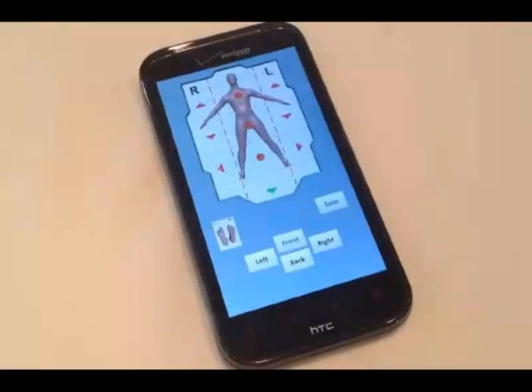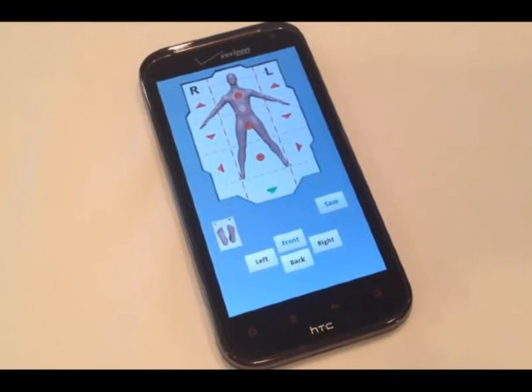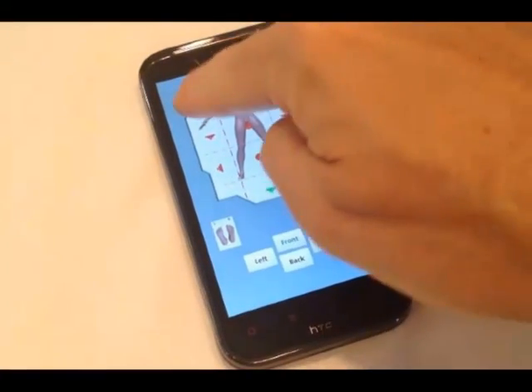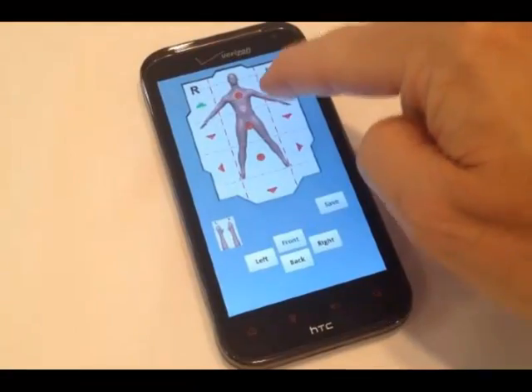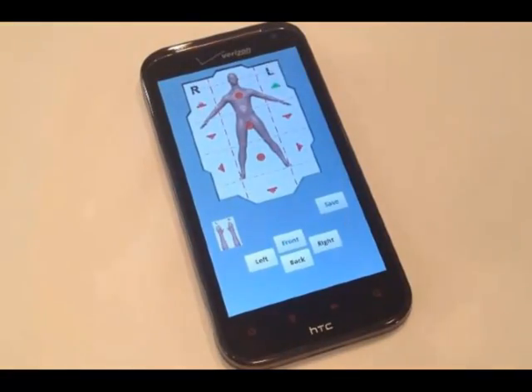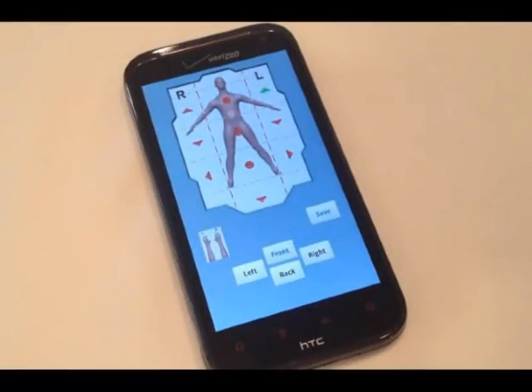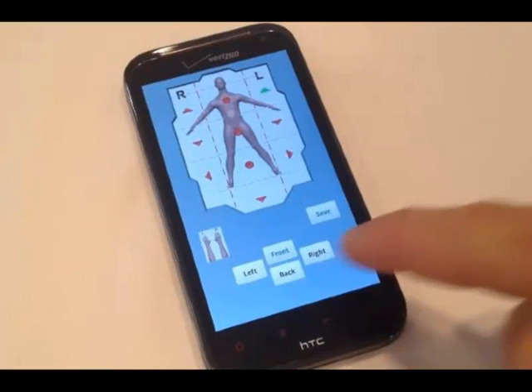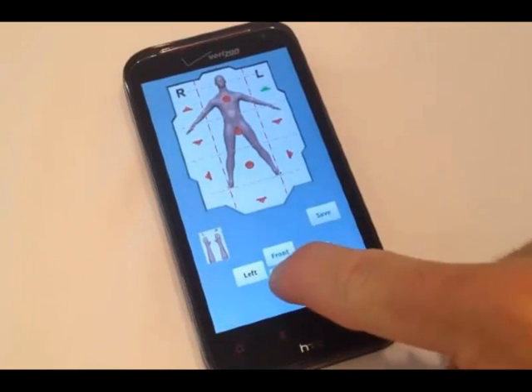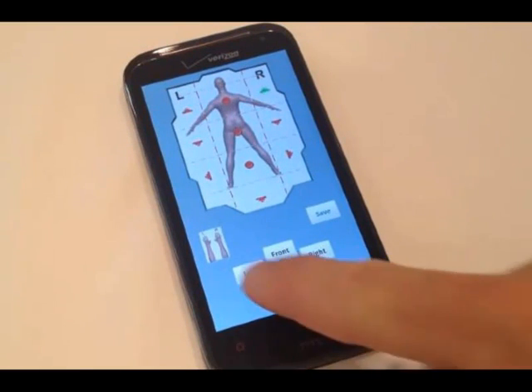Tap the location button. A body part locator screen will display an image of a person. The body part locator is a grid divided into regions marked by an R for the right side of the body and an L for the left side of the body. At the bottom, you will see four directional buttons: Front, back, left and right.